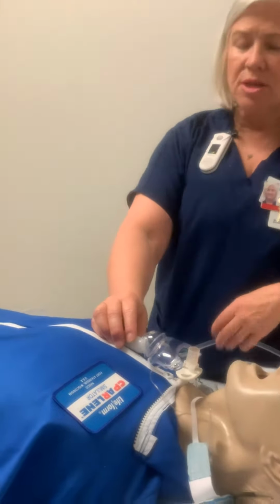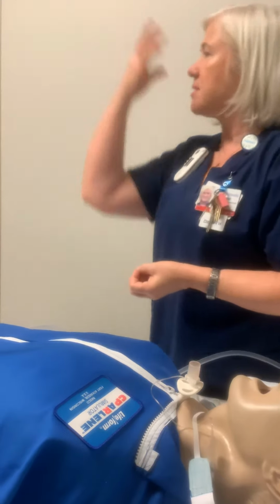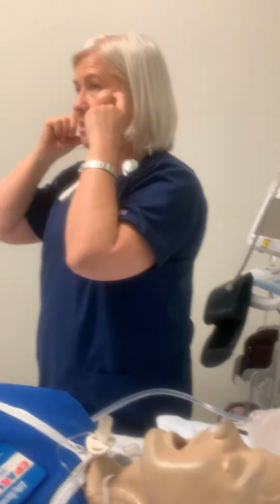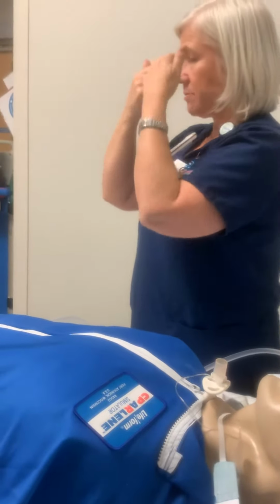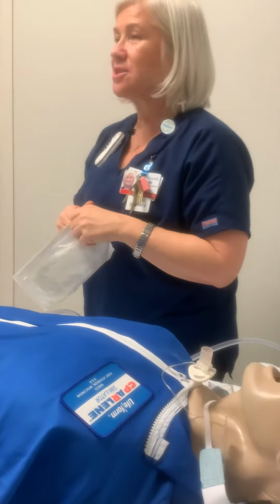They're okay. But let's say they're coughing and all of a sudden some little piece of sputum will pop out of there. And it's happened before, you know, getting your hair sometimes or something of that type. So I usually like to wear a mask with the shield up here to protect my eyes. But it's your call. You don't have to, but I like to do that, okay? So I've got it set at 150.